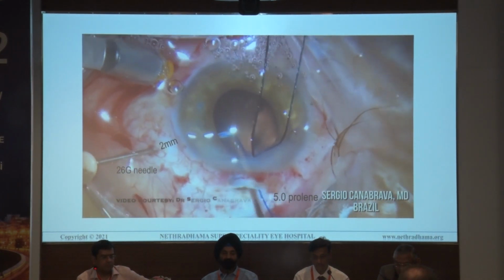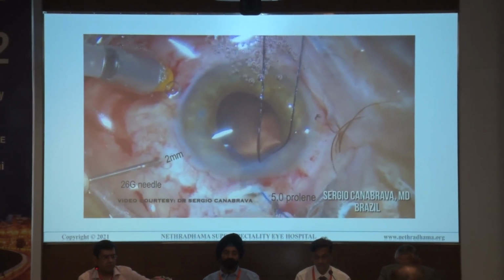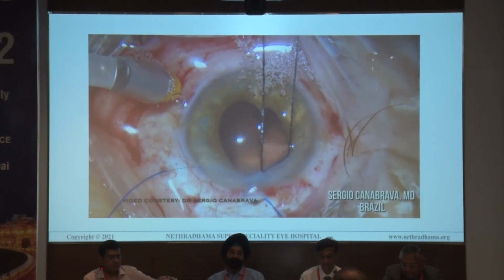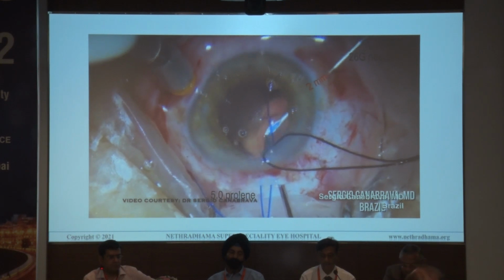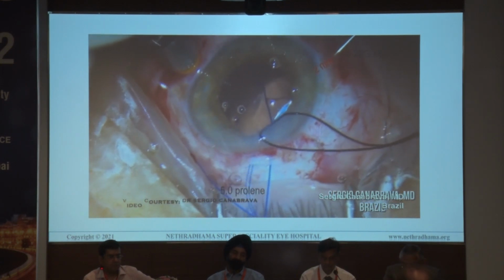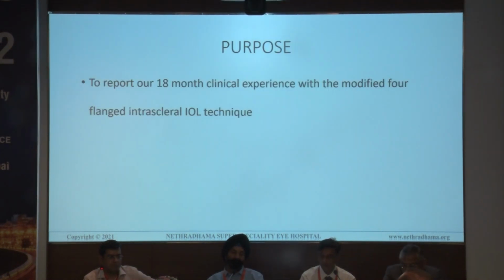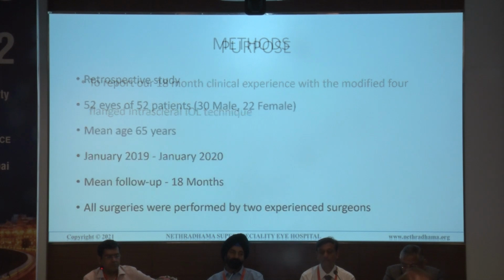In the original four flange technique, the 5-0 prolene suture is fed into the lumen of the hypodermic needle within the anterior chamber and exteriorized through a sclerotomy 2 mm from the limbus on either side. Further description of the technique I'll give in the further part of the paper. Now, the purpose of this study is to report our 18-month clinical experience with the modified four-flanged intrascleral IOL technique.